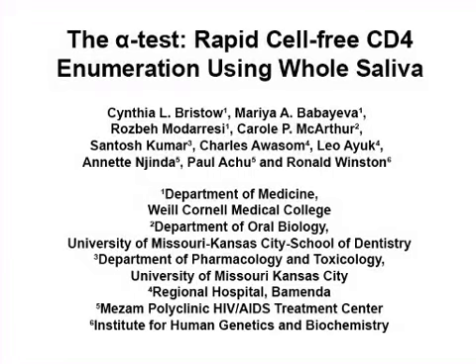There is an urgent need for affordable CD4 enumeration to monitor HIV disease in resource-limited regions. This video demonstrates a low-cost point-of-care screening test in which CD4 counts are determined based on the presence of the proteinase inhibitor alpha-1-PI in saliva.